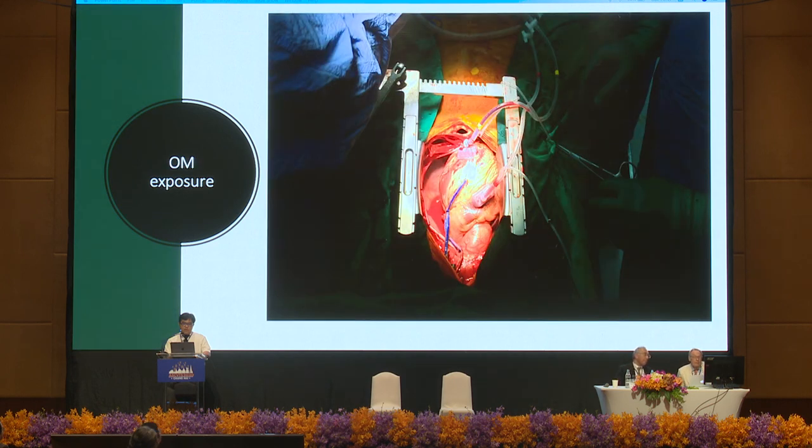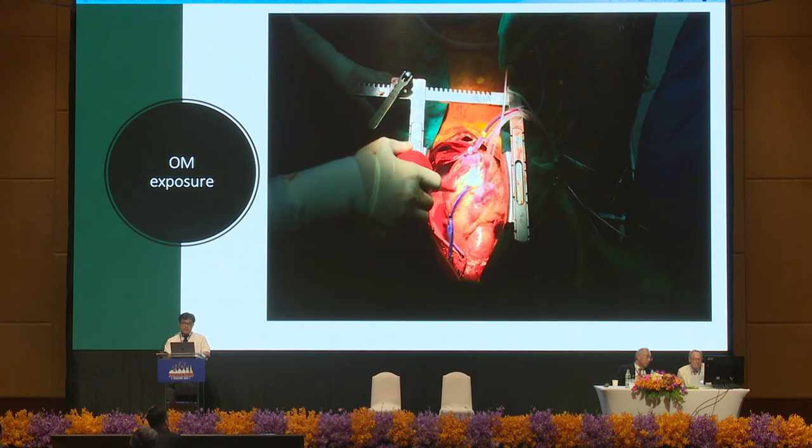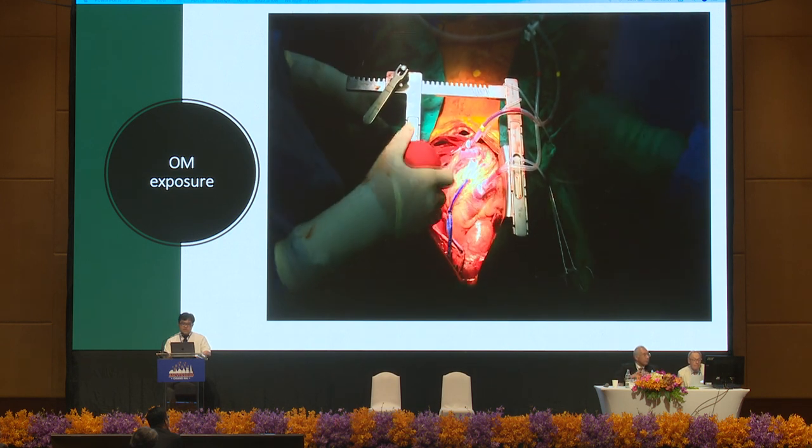This is the way we do the OM exposure. We do it gently, and we can do almost every case like this. This video may be 5 or 6 years ago.